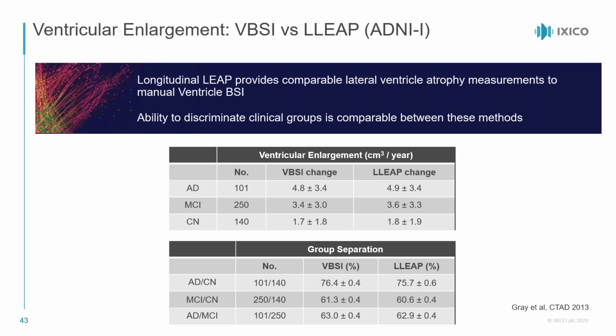So in these slides, we've demonstrated that the LEAP method performs comparably against a commonly employed standard, the BSI, using best practice semi-automatic initialization. However, LEAP has the advantage of being fully automatic, flexible, and scalable to allow therapeutic specific validation in clinical trials.